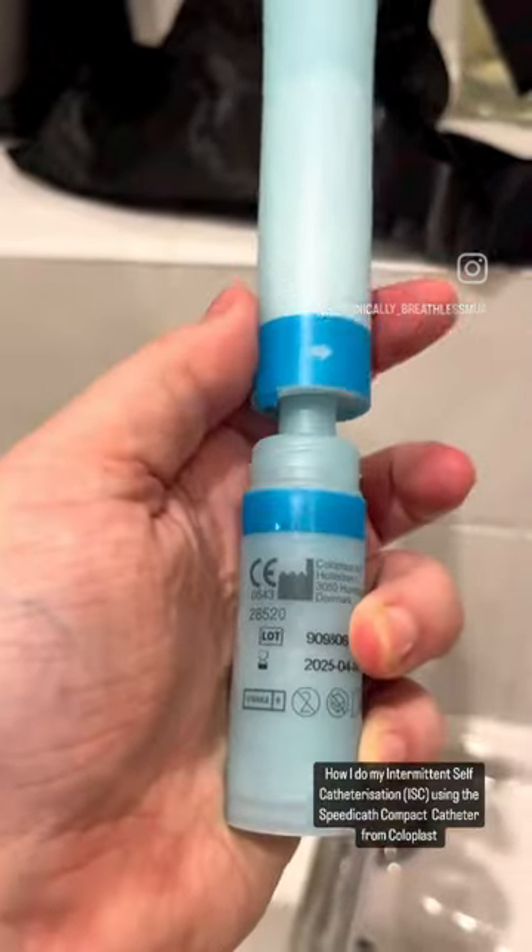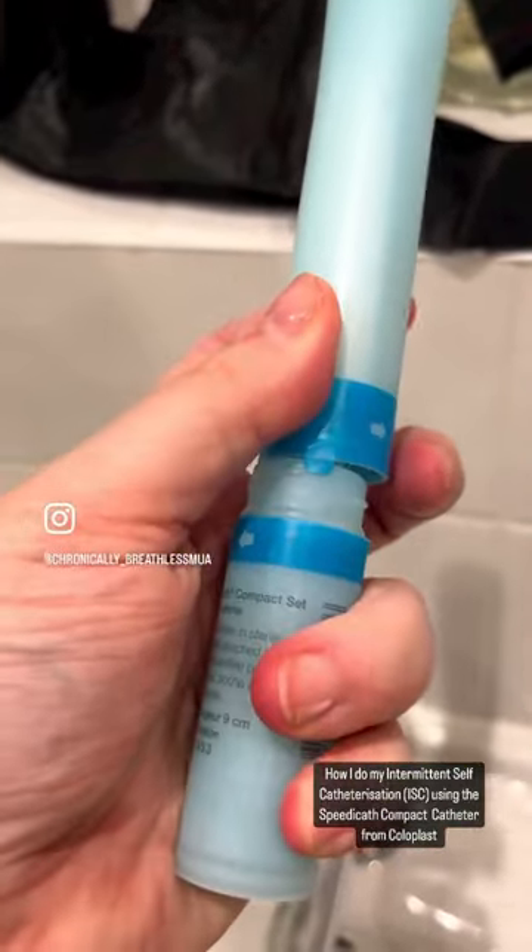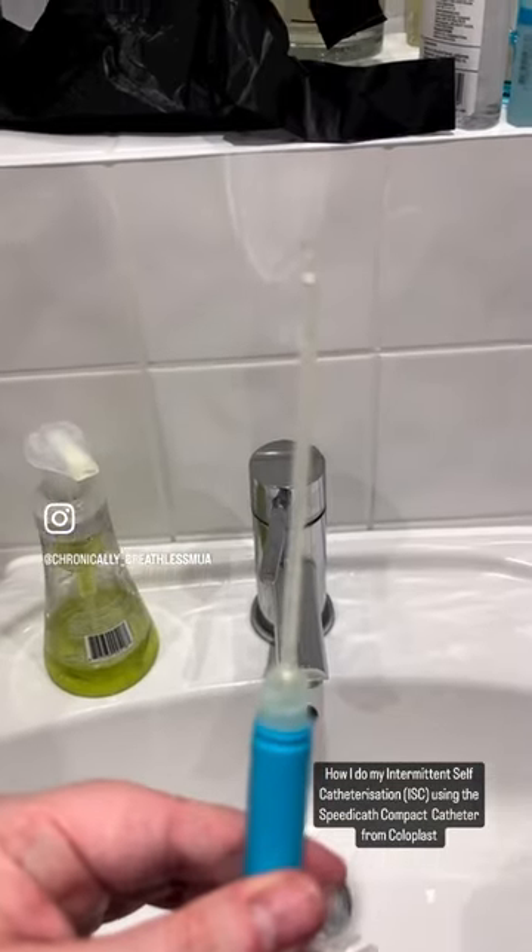Take the top off the catheter, being careful not to touch the tip and contaminate it. Hold from the base, take your time for insertion, then pop it in the rubbish bag — and you're done.